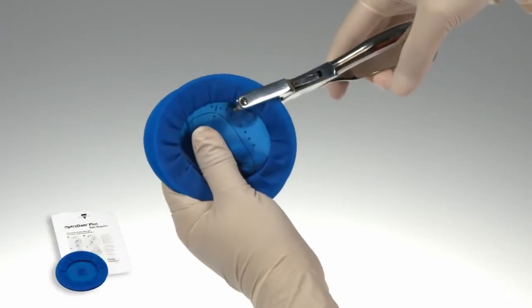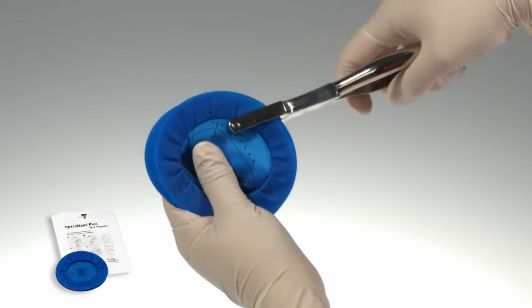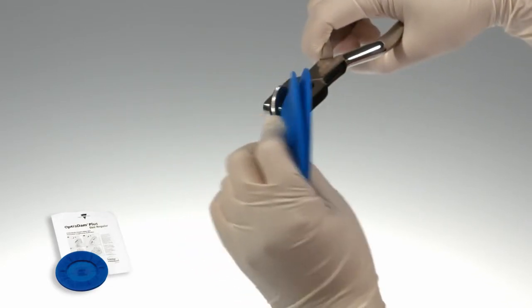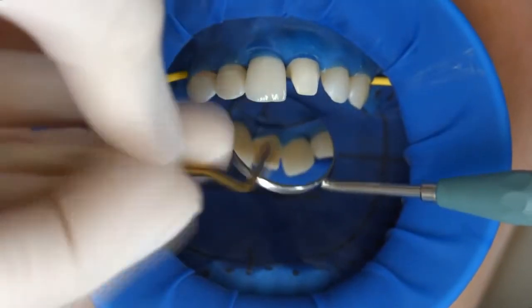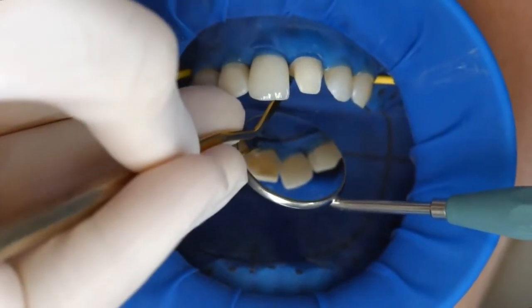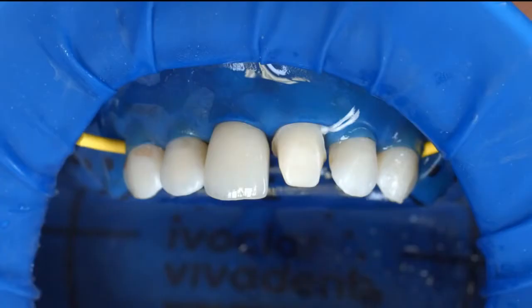When an adhesive luting protocol with composites is used, reliable isolation of the operating field is indispensable. Preferably place an anatomically shaped rubber dam such as the Optradam, or alternatively use cotton rolls and a saliva ejector.